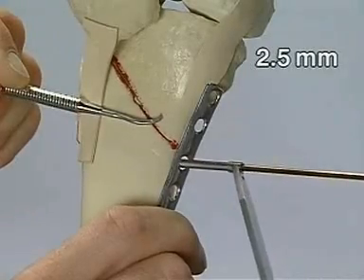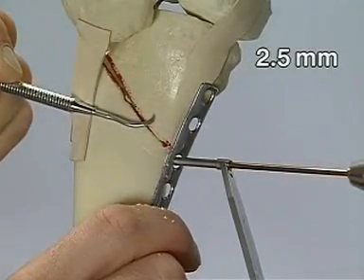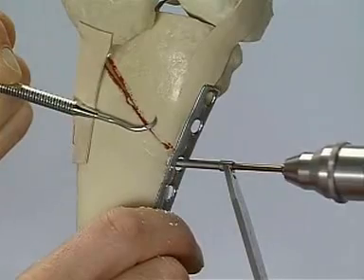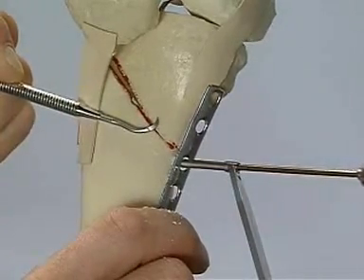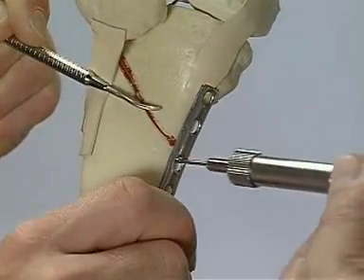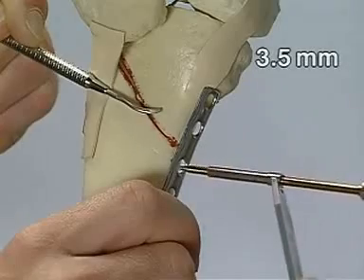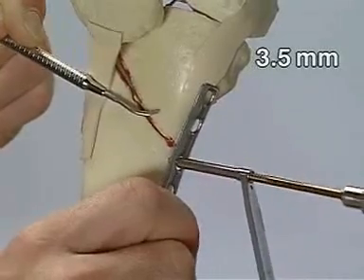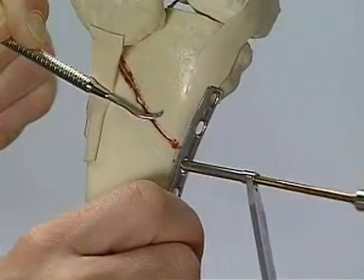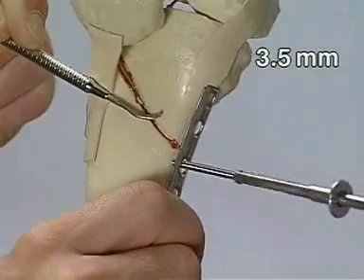Next, a 2.5 mm hole is drilled just distal to the apex of the fracture. Measuring with the depth gauge. Tapping with the 3.5 mm tap. Insertion of a cortical screw through the middle hole of the plate.